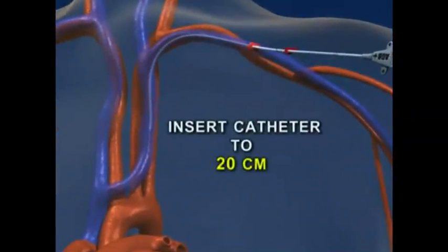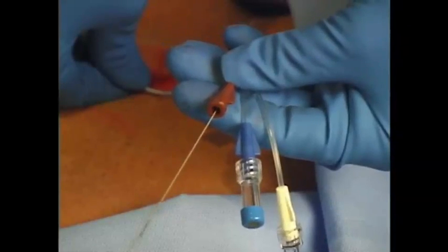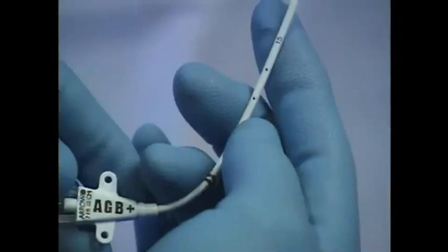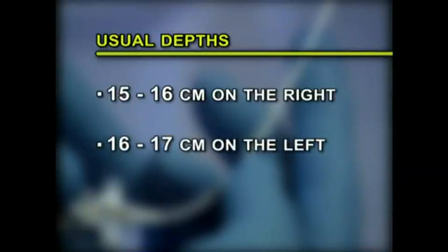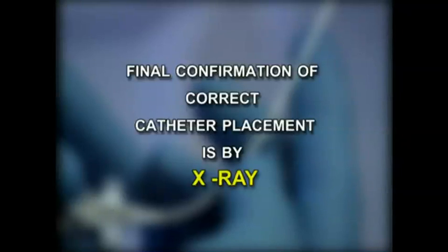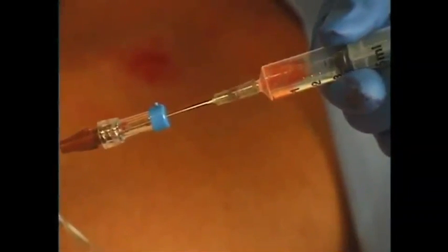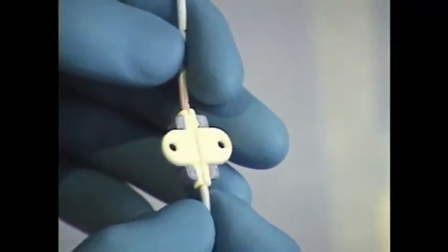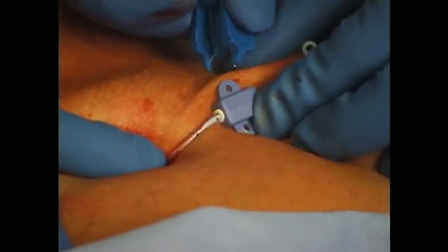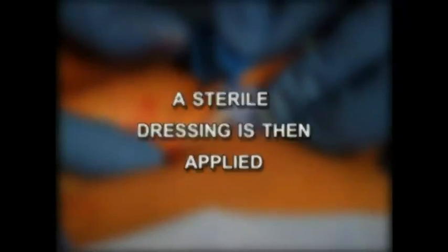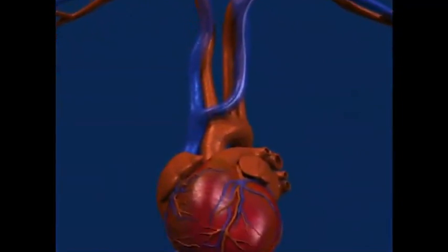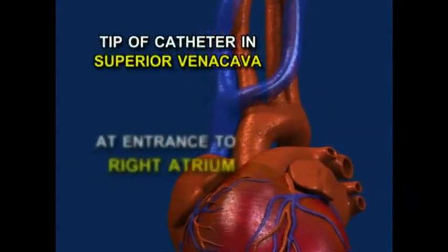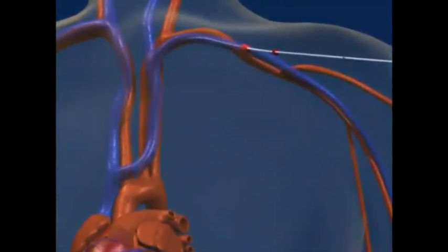Once the catheter has been inserted to 20 centimeters, the wire is removed. The catheter can then be positioned at the appropriate depth; it has markings indicating the centimeters distal to the insertion site. Usual depths are 15 to 16 centimeters on the right and 16 to 17 centimeters on the left. Final confirmation of correct catheter placement is by x-ray. Each port is then aspirated and flushed with sterile saline. The catheter is secured in place by placing the catheter holder on the catheter and securing it to the skin with staples or sutures. A sterile dressing is then applied. A chest x-ray is obtained to look for an iatrogenic pneumothorax and confirm correct line position. The optimal position is to have the tip of the catheter in the superior vena cava at the entrance to the right atrium, but placement anywhere in the superior vena cava is acceptable.